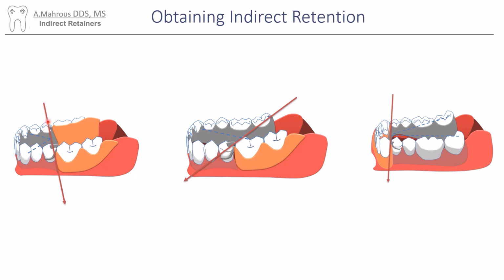In a class 1, you'd usually end up at the central incisors, which are not that strong. So it's recommended to split that line into two in order to hit the canines. A similar situation exists in a class 4, where it's recommended to split that indirect retainer line into two, therefore hitting the two back molars, which are going to be direct retainers anyway.